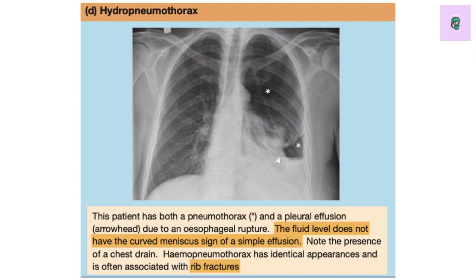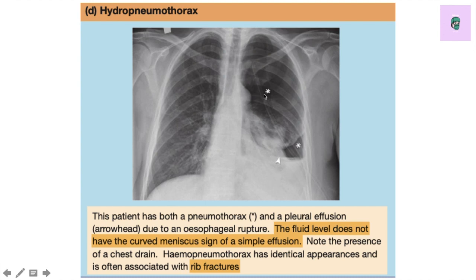Next is hydropneumothorax. When we studied pleural effusion we saw blunting of the costophrenic angle, and here you can also see blunting — but the patient has both pneumothorax and pleural effusion. This can be due to an esophageal rupture. The fluid level does not have the curved meniscus sign of a simple effusion; a simple effusion would show a clean meniscus without this haziness. Note that a chest drain has been placed. Hemopneumothorax has identical appearances and is often associated with rib fracture.